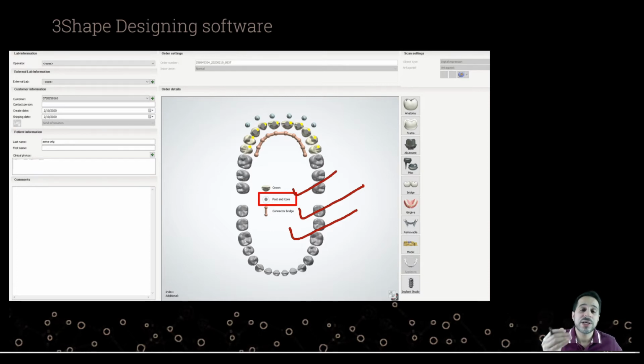In such a case, the patient has an old bridge, and she doesn't have posteriors. She needs time to make an implant, and all the 6 anteriors are really weak. They are supported by posts. Even if you have the ferrule effect, the teeth are still weak. The lifetime for these teeth will not survive for a long time.